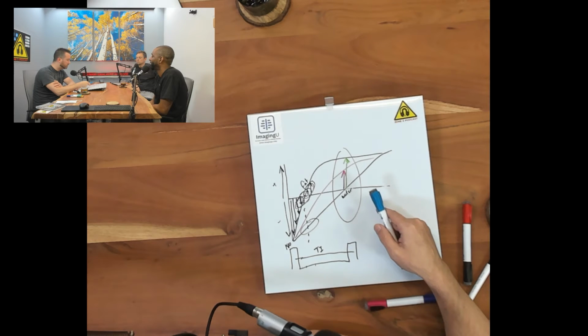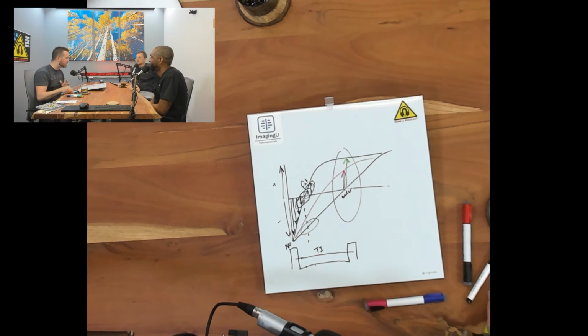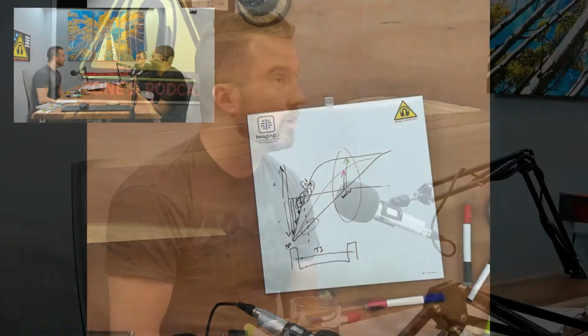It's a concept that I teach in some classes, and people say, yeah, I understand this stuff, and then I show them and they say, oh, okay, I got it now. I think T1 recovery is one of the most underrated and underutilized concepts, not really applied or understood. That can be really limiting to someone who wants to expand their physics knowledge and do more things. I know in cardiac they do almost triple IRs, right? You do three inversions. So those scans have to be long, because you're waiting even longer because of how many inversions you're doing.